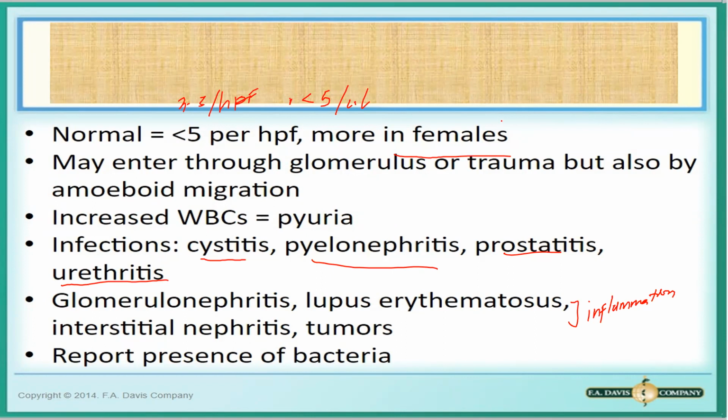So sa girls out there, if you are familiar with white menstruation na tinatawag or the vaginal discharge, which is normal na normal sa mga babae. Yun yung common na pinanggagalingan ng contamination. So, yung vaginal discharge, it contains WBC, and yun yung usually na sumasama sa urine.